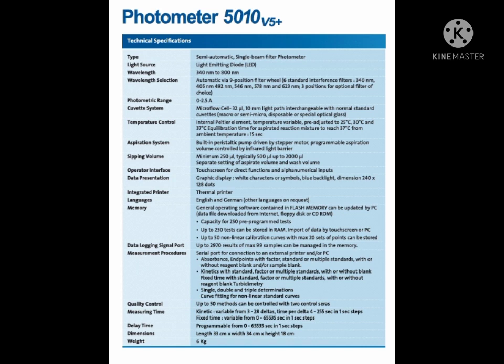Cuvette system, microflow cell 32 microliter 10 mm light path interchangeable with normal standard cuvette.